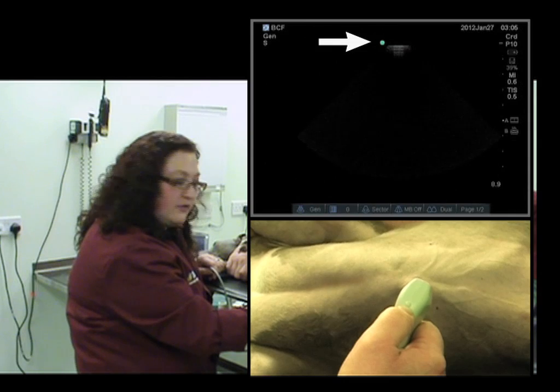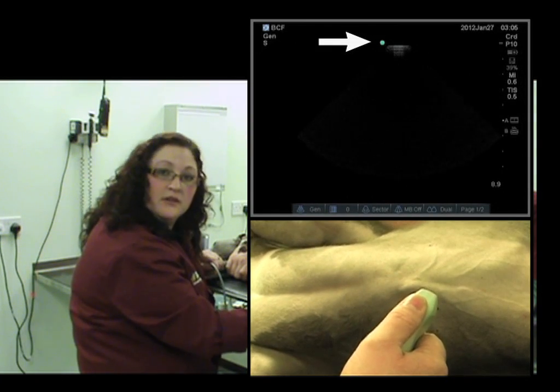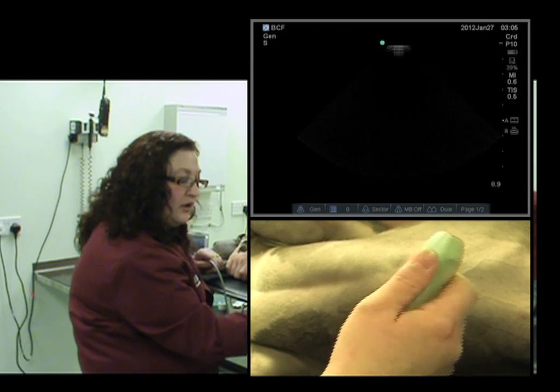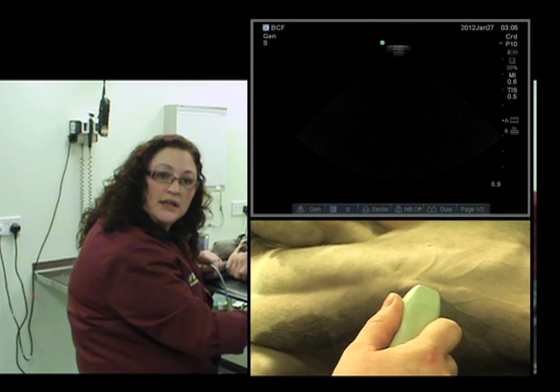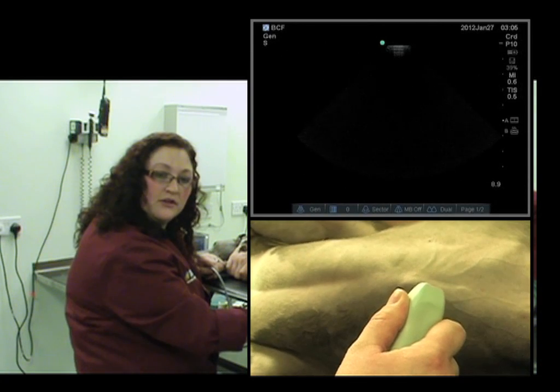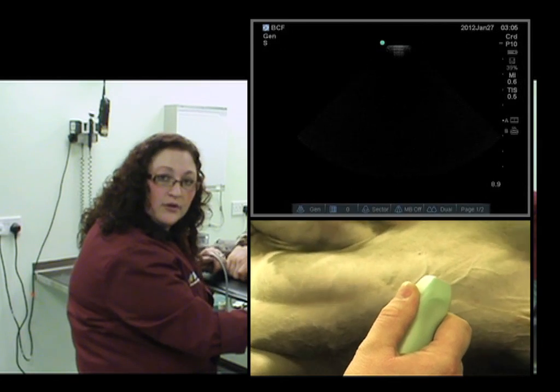And that tells us where in relation to our thumb the image is being displayed on the screen. So for example, if my thumb is on the notch and it's pointed cranially, I know that on this particular image the blue dot is also cranial. So that helps me orientate myself.